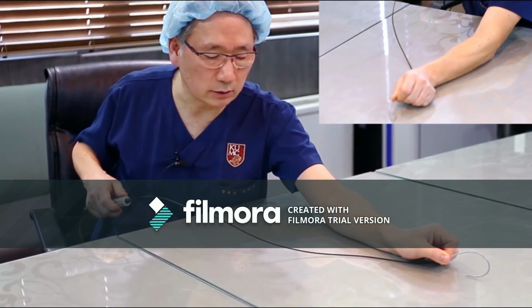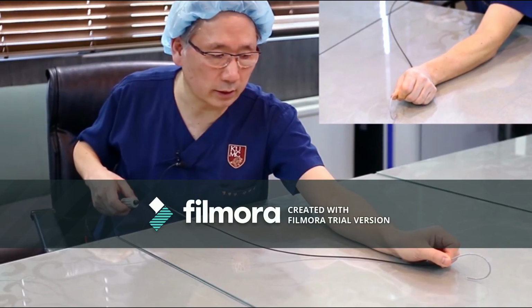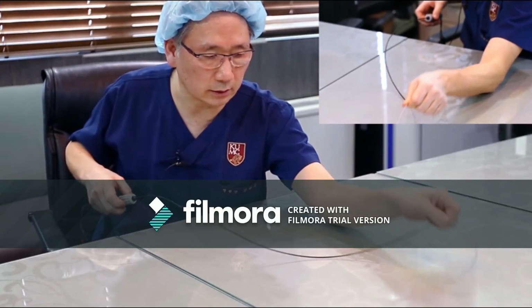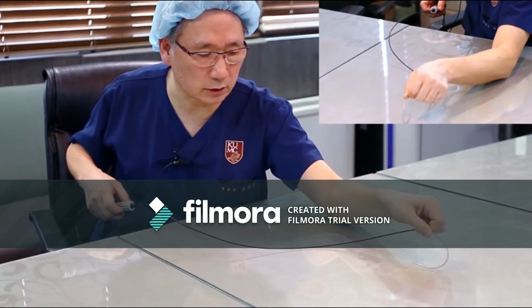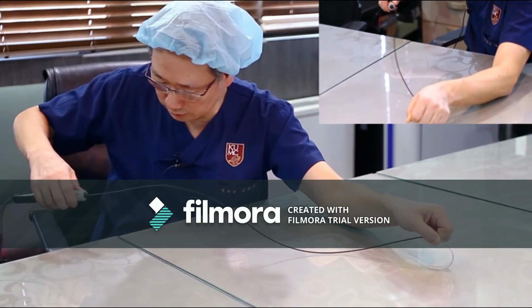Go to the LAO 30 degree view. LAO 30 degrees may have the potential to show the posterior.